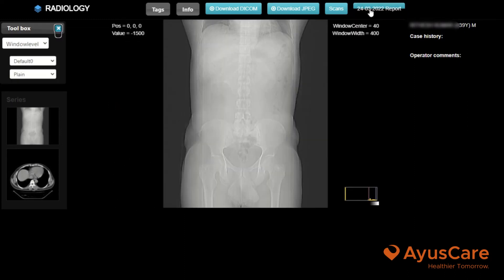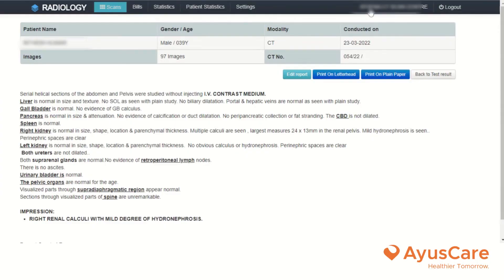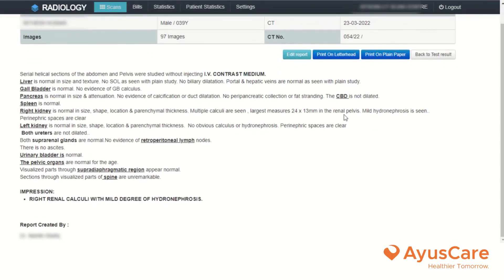You can click this particular report and see the report of the patient, and also print.